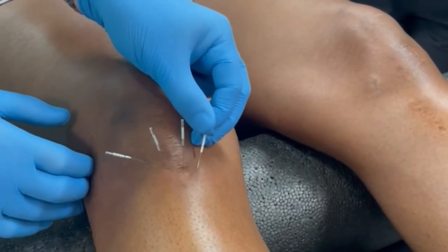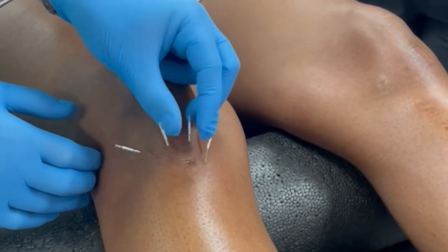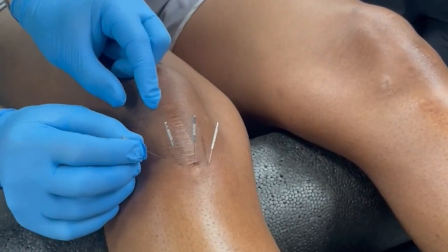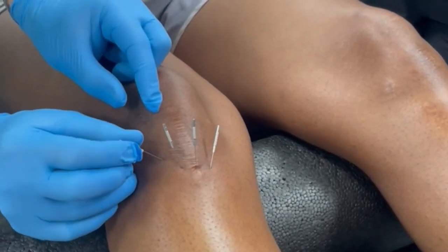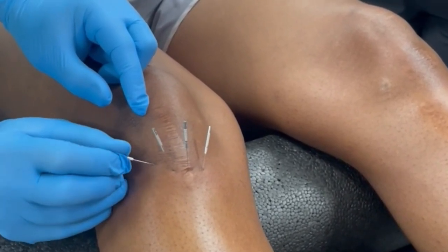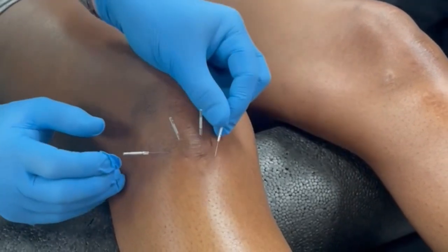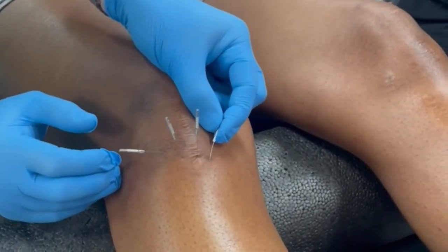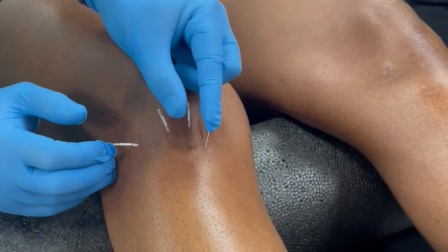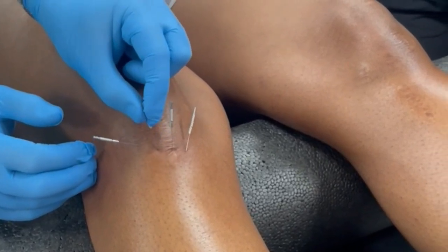I'm going to spin these up a little bit. See how when I have it spun and it's tight and I pull on it? I can feel it, but they don't. See what it's doing to the other needles? That one hurts the most. Oh, that's nice and tight there.